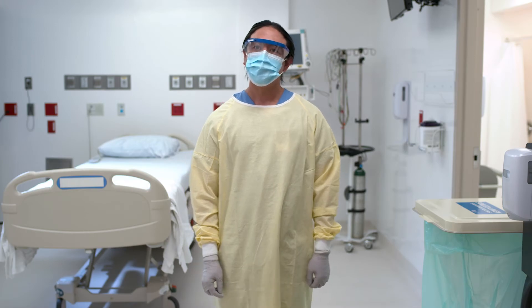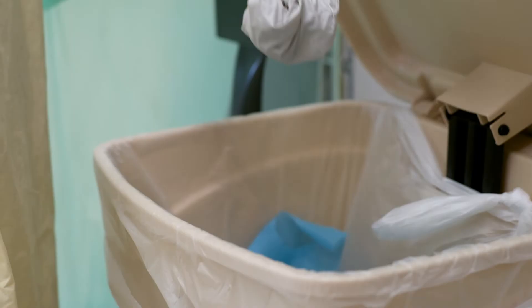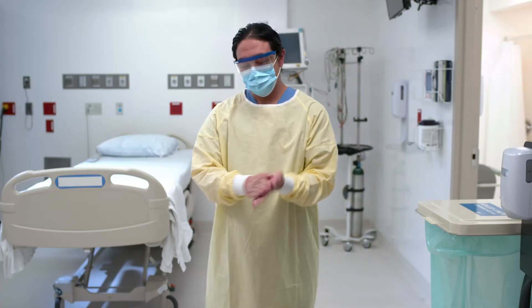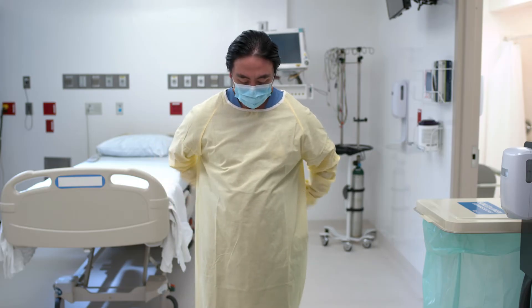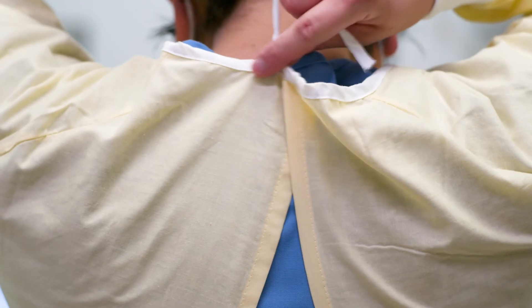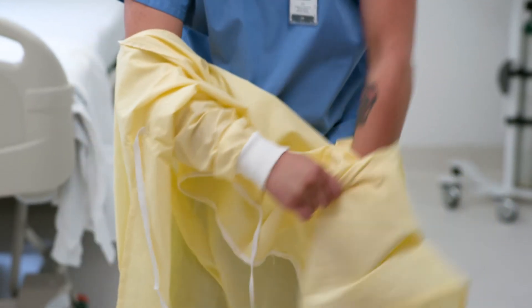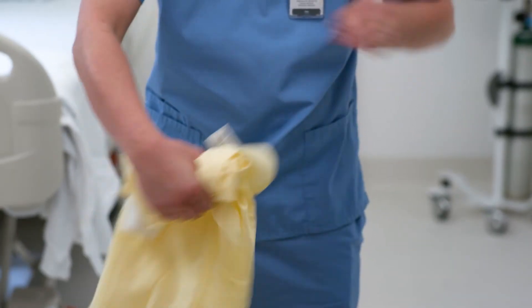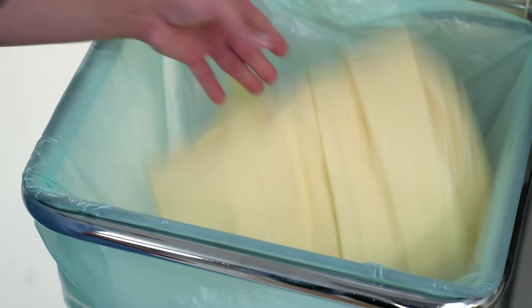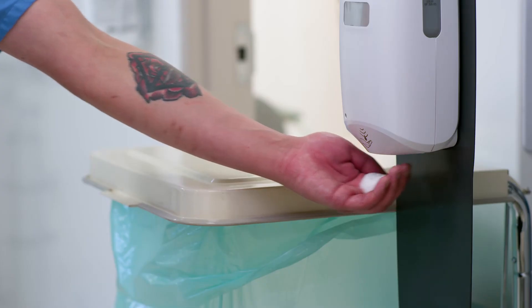Let us also show you how to remove reusable gowns. For reusable gowns, the order of doffing is slightly different. First, remove gloves and perform hand hygiene. Then remove goggles or face shield. Unfasten gown ties or snaps, taking care that sleeves don't contact your body when reaching for ties. Pull the gown away from the neck and shoulders, touching the inside of the gown only. Turn the gown inside out, fold or roll into a bundle, and place into a designated receptacle for reprocessing. Next, remove the mask or respirator. And last, hand hygiene.